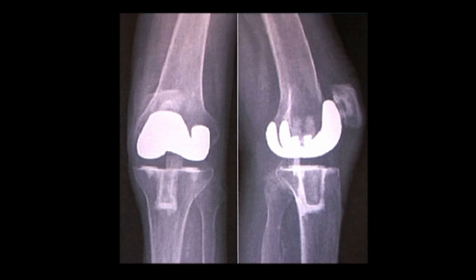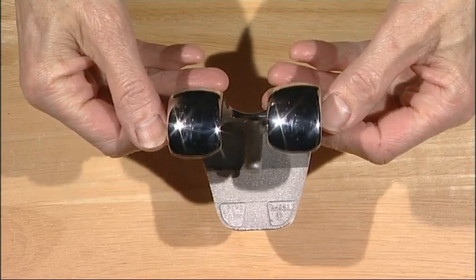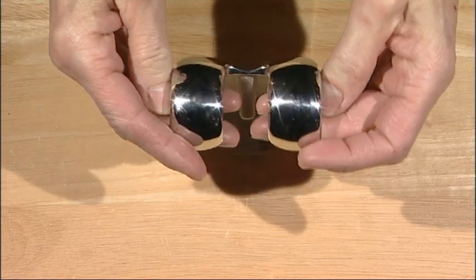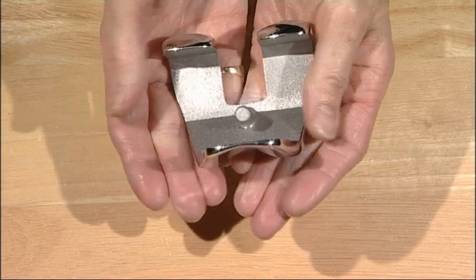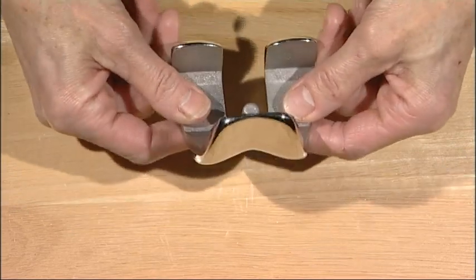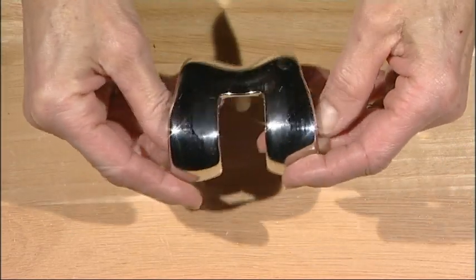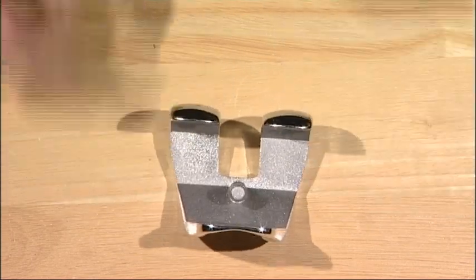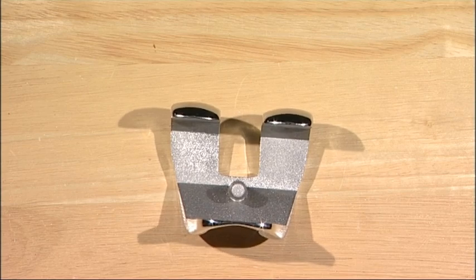The tibia was initially all polyethylene. The tibial geometry was dished in both the AP and ML planes, giving it a semi-constrained action which relied on correct tension in the collateral ligaments. This followed the principles established by Freeman and Swanson. Their early work on resurfacing prostheses was the first to explore the principle of soft tissue balancing, as well as surface fixation without stems. This was to reduce possible spread of infection along the intramedullary stems.